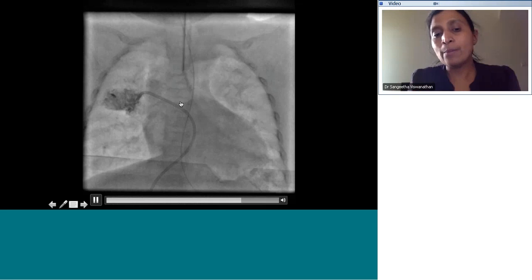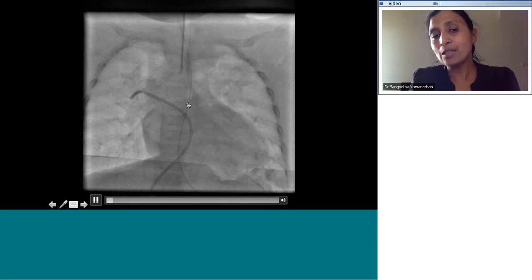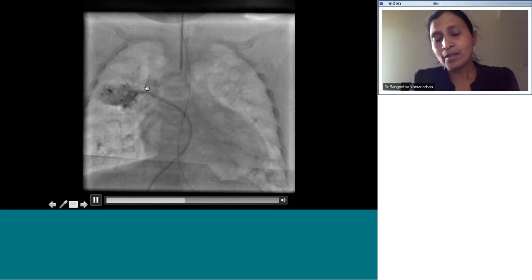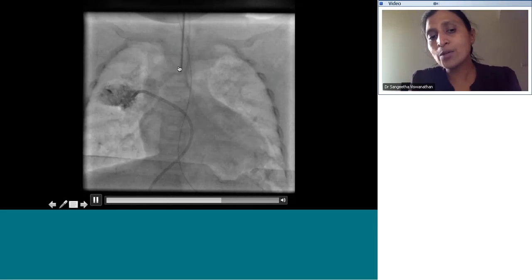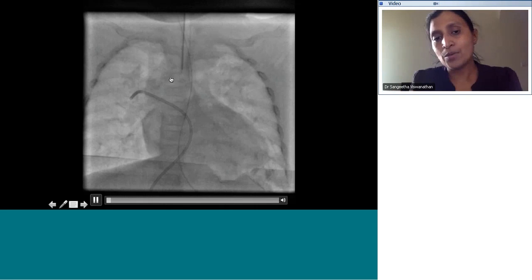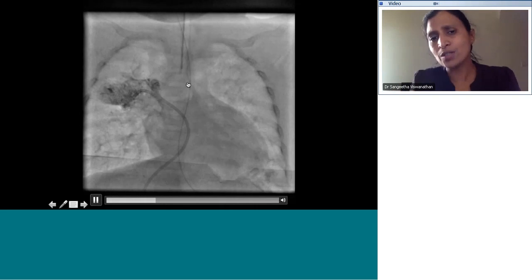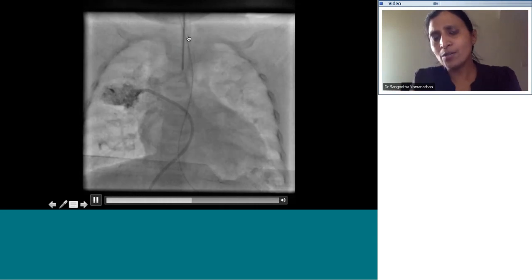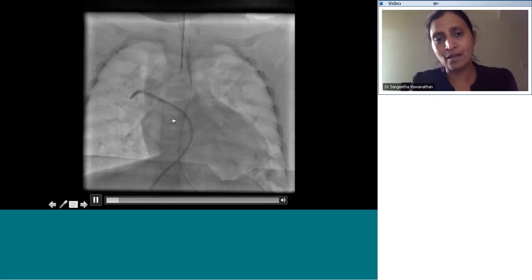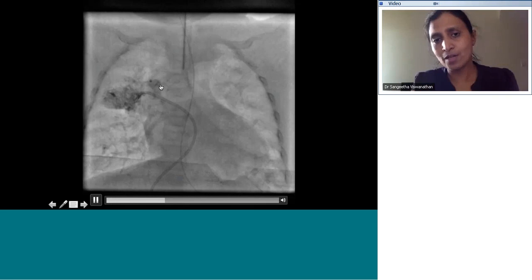So there may not be any pulmonary arterial confluence, like there's just a beak-like appearance there. The other thing you notice happening is that you get contrast entering the bronchus. So sometimes when you do this injection quite forcefully, you can get contrast entering the bronchus during the injection. Do you notice that going up?